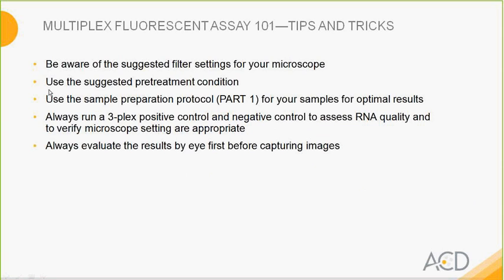And these are just a summary of what we have discussed. We encourage you to use the sample preparation protocol part 1 for your assays when you're using multiplex fluorescent assay. Another recommendation is to use 3-plex positive control and negative control to assess RNA quality. And as indicated, always evaluate the results by your naked eye first.